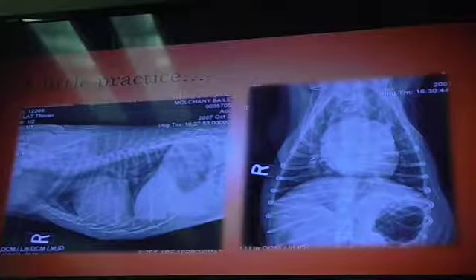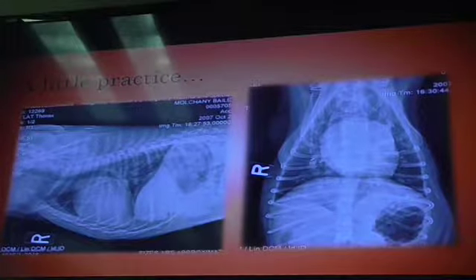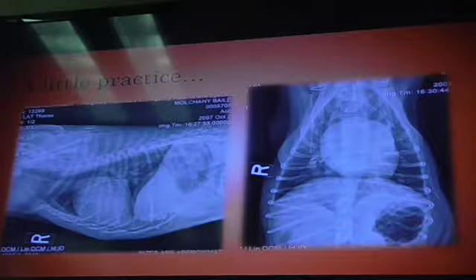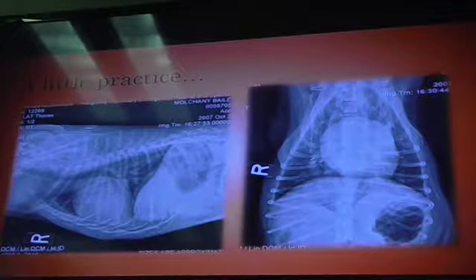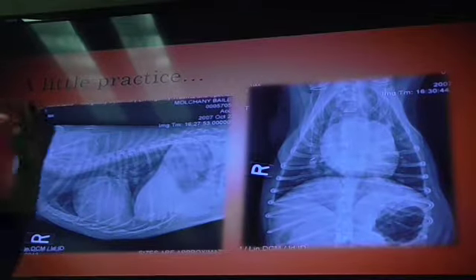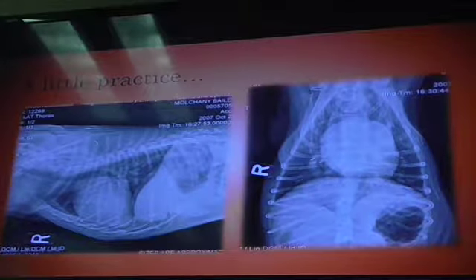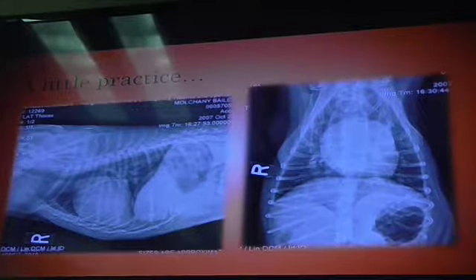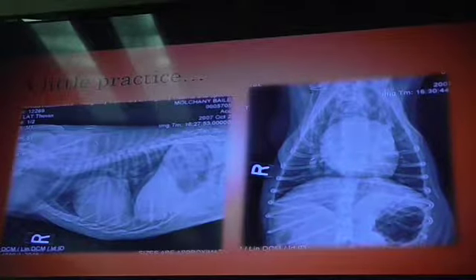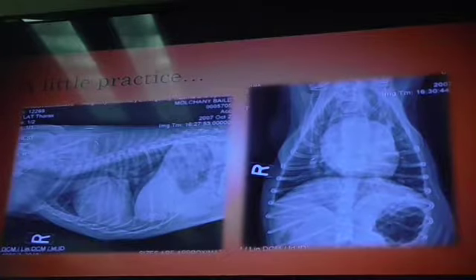You want to be careful, and it does get you a lot, trust me. Especially when you're seeing those early signs of that alveolar pattern and you're seeing those cranial lobes being affected, and it looks like it's circumscribing something. You guys remember that? It looks like Spider-Man coming up. Like somebody's doing this. Y'all not with me? I'm imagining. I'm putting my imagination down. All right. You just got to be mindful of your normal anatomy in that situation.